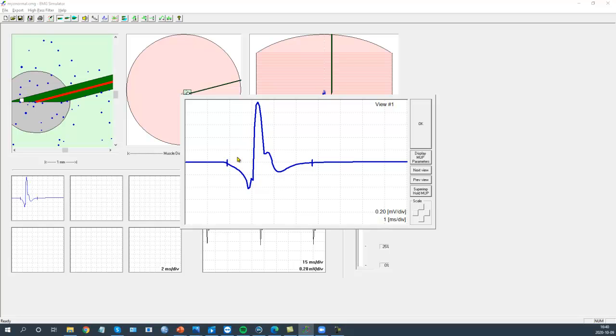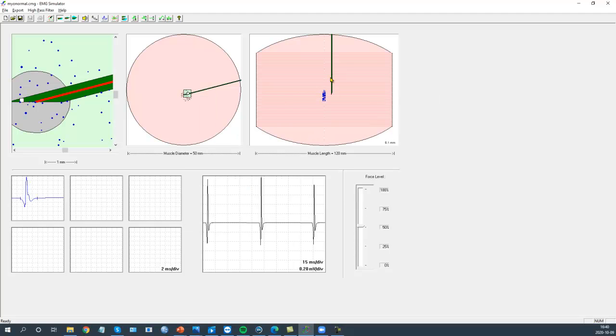This may be one of the reasons why in myopathy we have both normal motor unit potentials and so-called abnormal motor unit potentials. It is important from this little experiment that we use a standardized position for the recording, similar to the one we have used when collecting reference material.